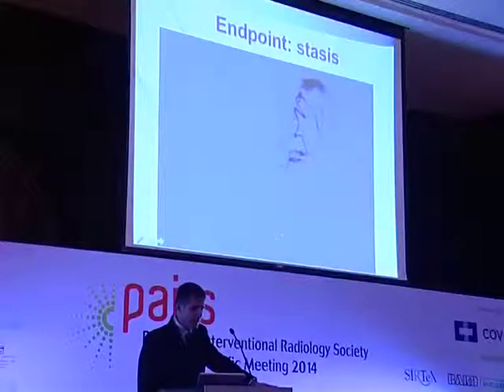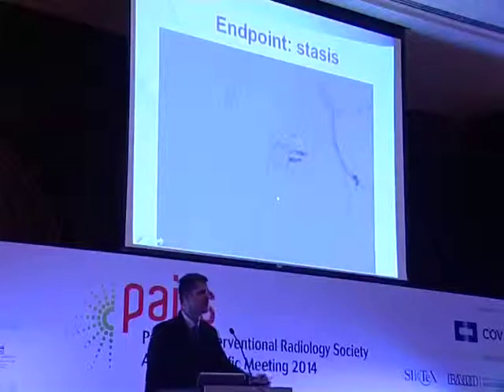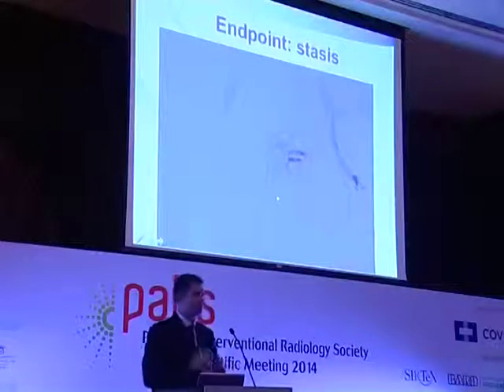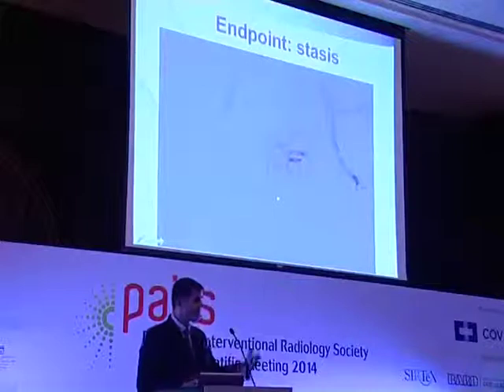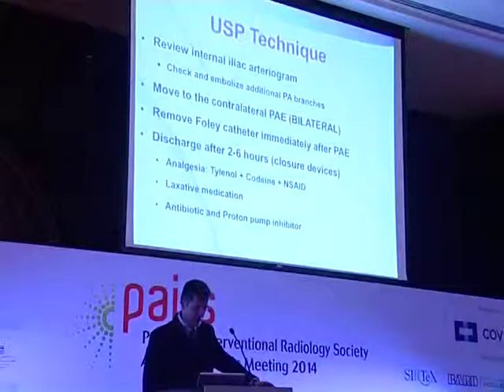We want full devascularization of the prostatic gland to get very good results. We need full devascularization of the prostate to have a procedure that can be compared to other very good treatments like TURP and laser and even open prostatectomy. But for that, we need to improve our results and our technique.